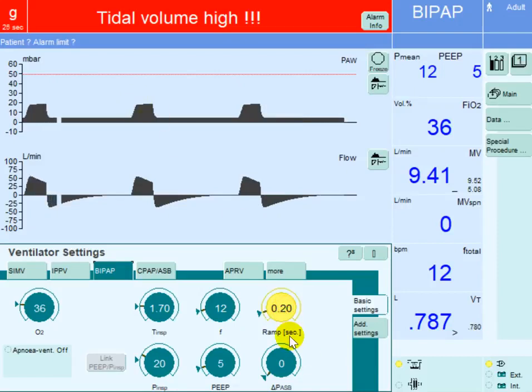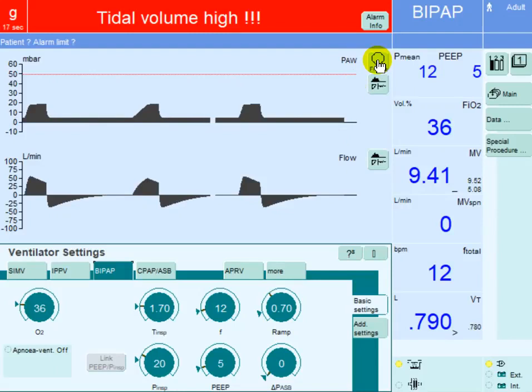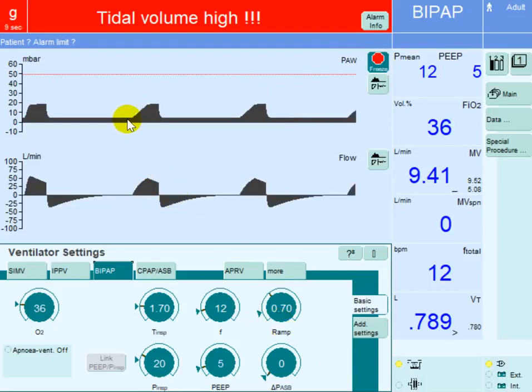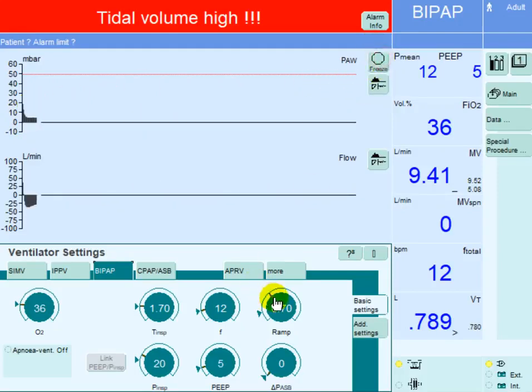Now let's change this — I'll increase it to 0.7 seconds and you will see what happens with the ramp or rise time. This second breath is at 0.7 seconds, so the time required to go from this point to the inspiratory pressure of 20 is 0.7 seconds, compared to 0.2 seconds in the previous breath.